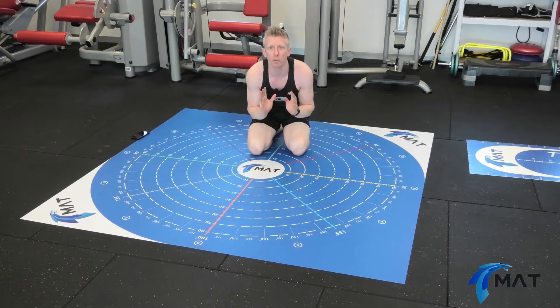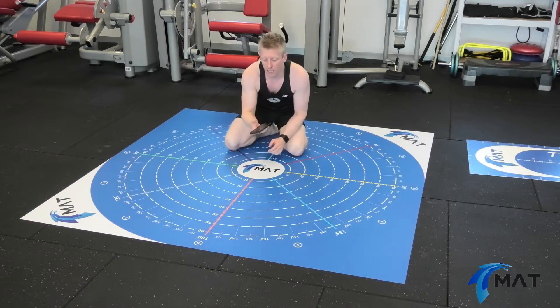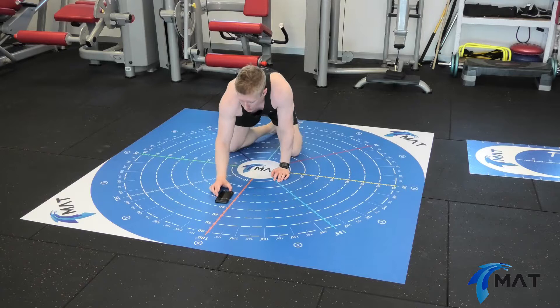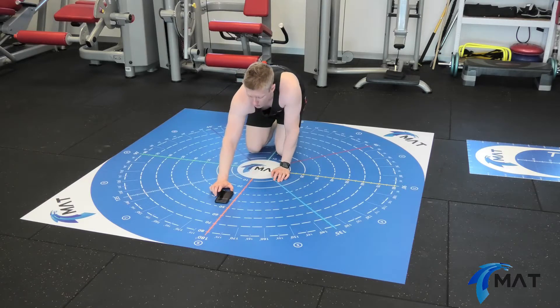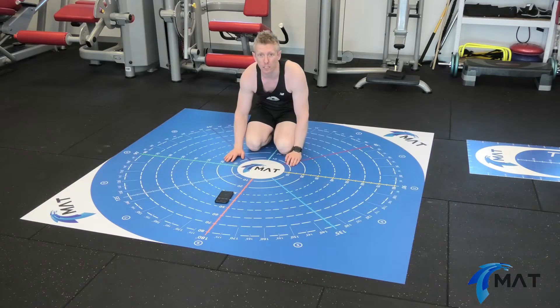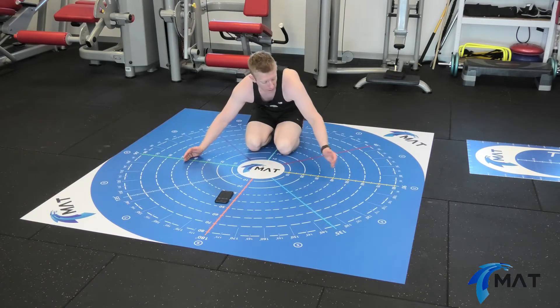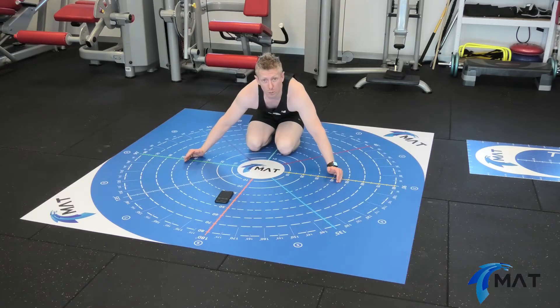Once I've finished the upper quarter Y balance test, I'm going to get my trusty stopwatch and start to perform the closed kinetic chain upper extremity test. For this test, we need two points marked out 90 centimetres apart. I'm going to pick the 45 centimetre point here and the 45 centimetre point here on the MegaMat.